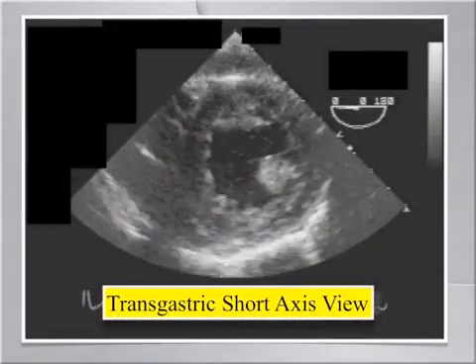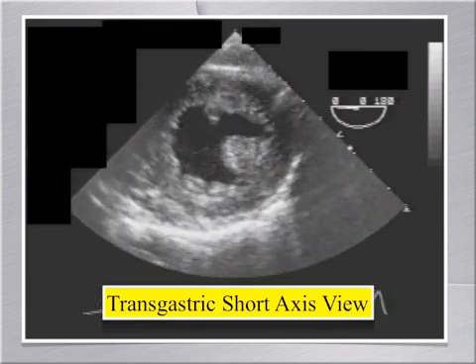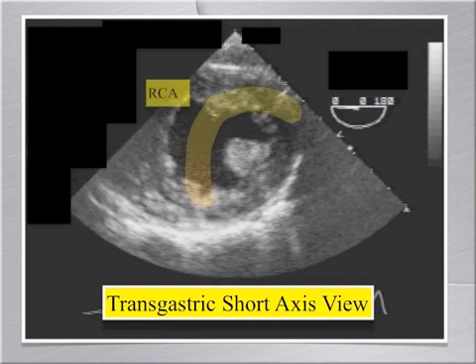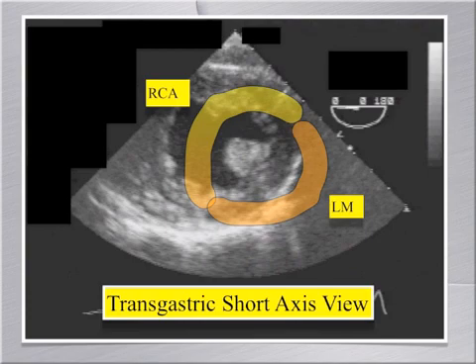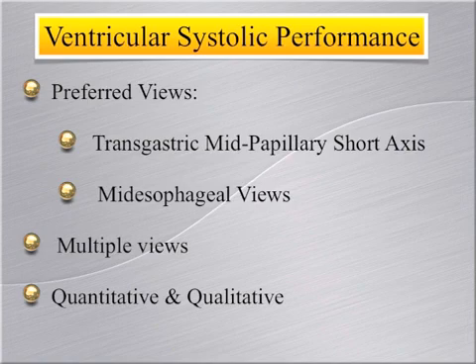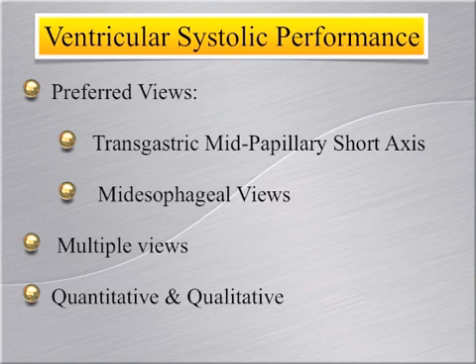We spend a significant amount of time looking at ventricular function in the mid-papillary transgastric short axis view. One advantage of this view is that it shows the distribution of both left and right coronary arteries in the same image, and is thus extremely helpful in initial assessment of ventricular function. While a popular starting point, it is by no means the only view or method for assessing ventricular systolic performance. The transgastric mid-papillary short axis view must be coupled with other transgastric and mid-esophageal views to gather both quantitative and qualitative data.